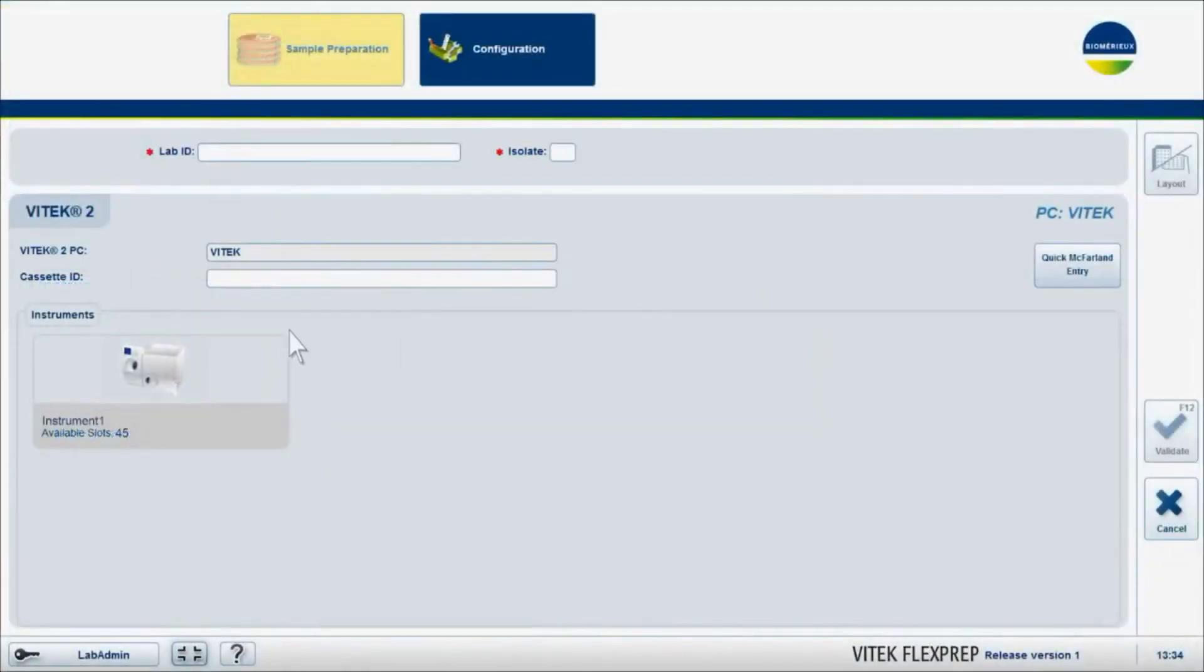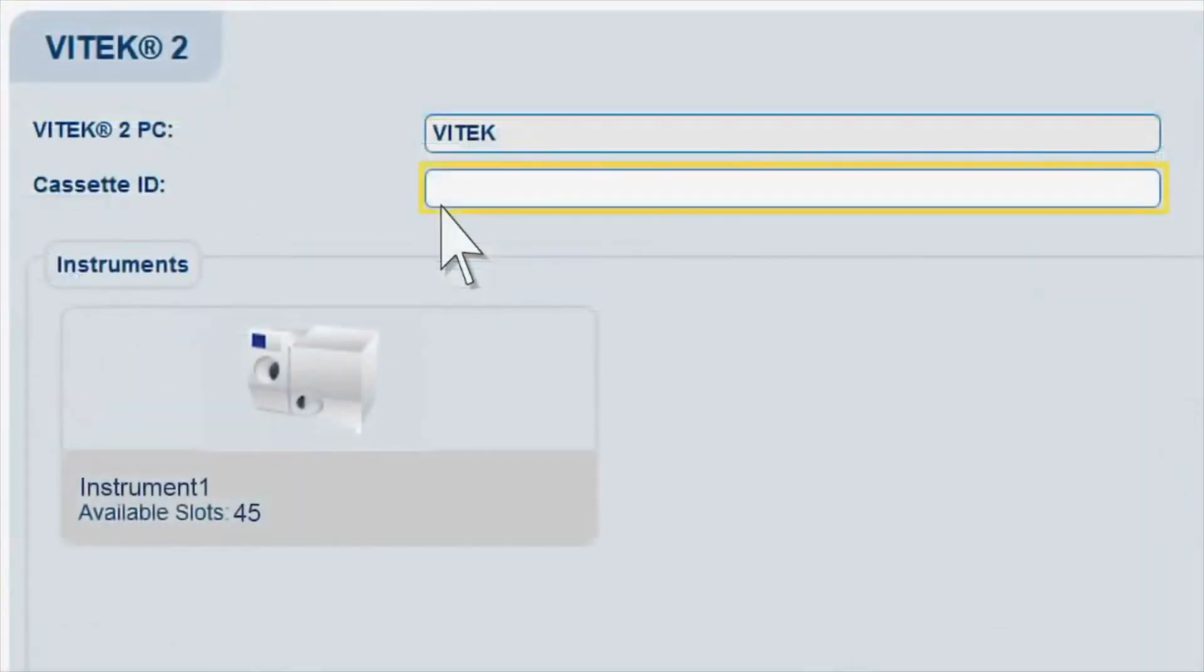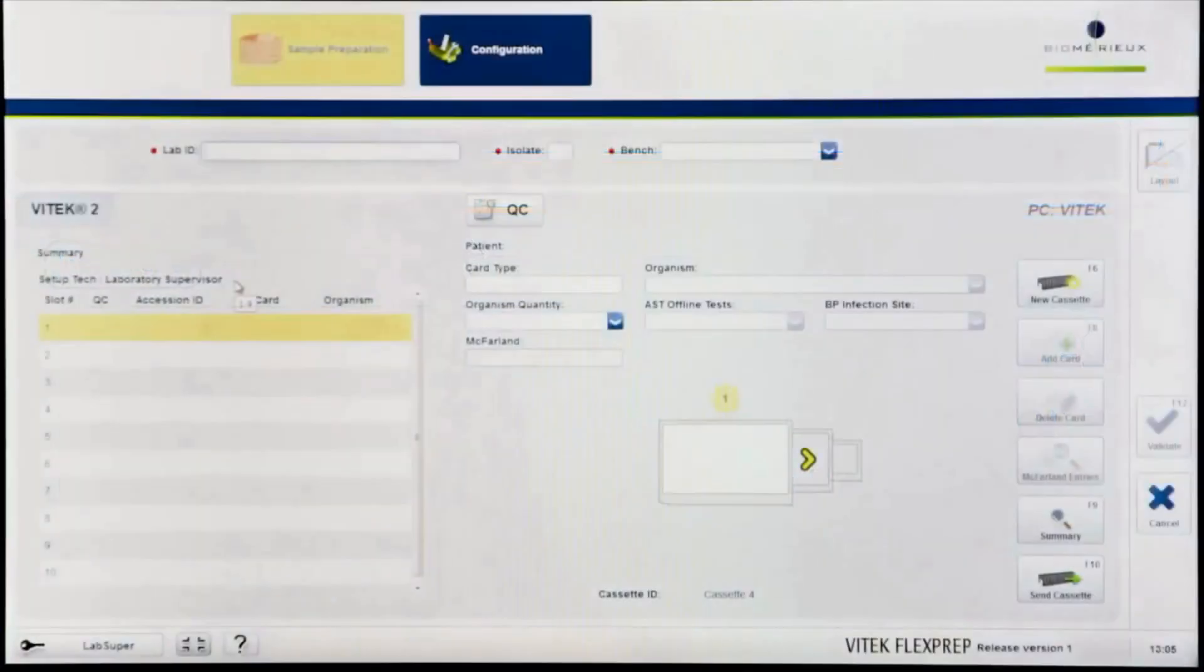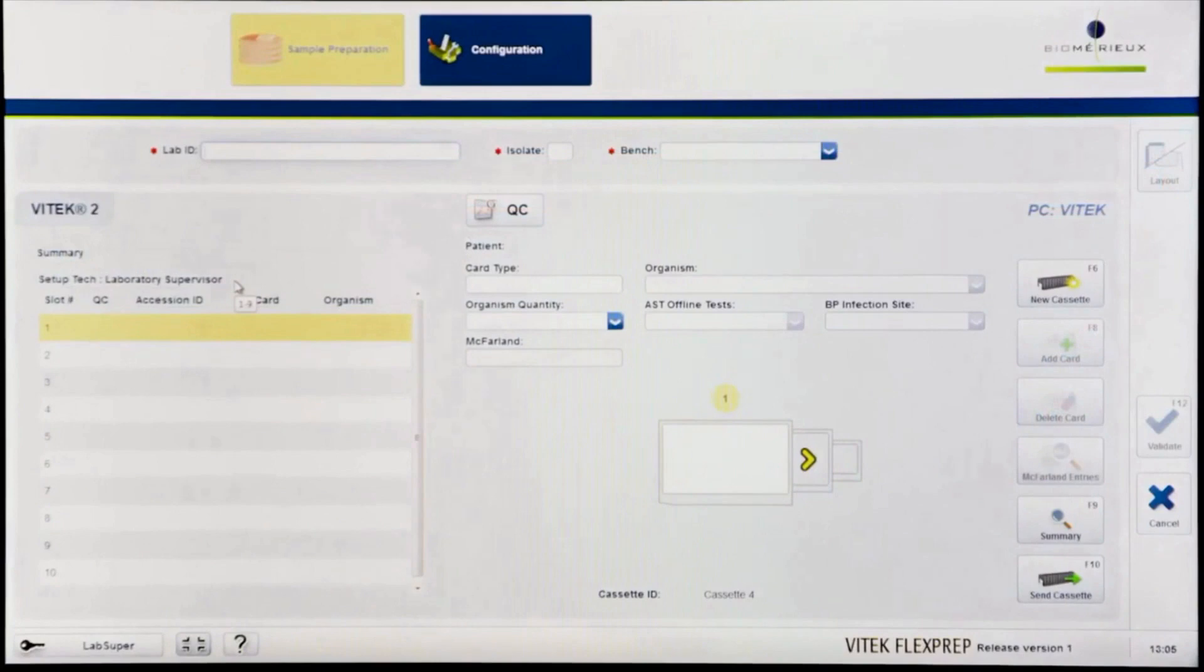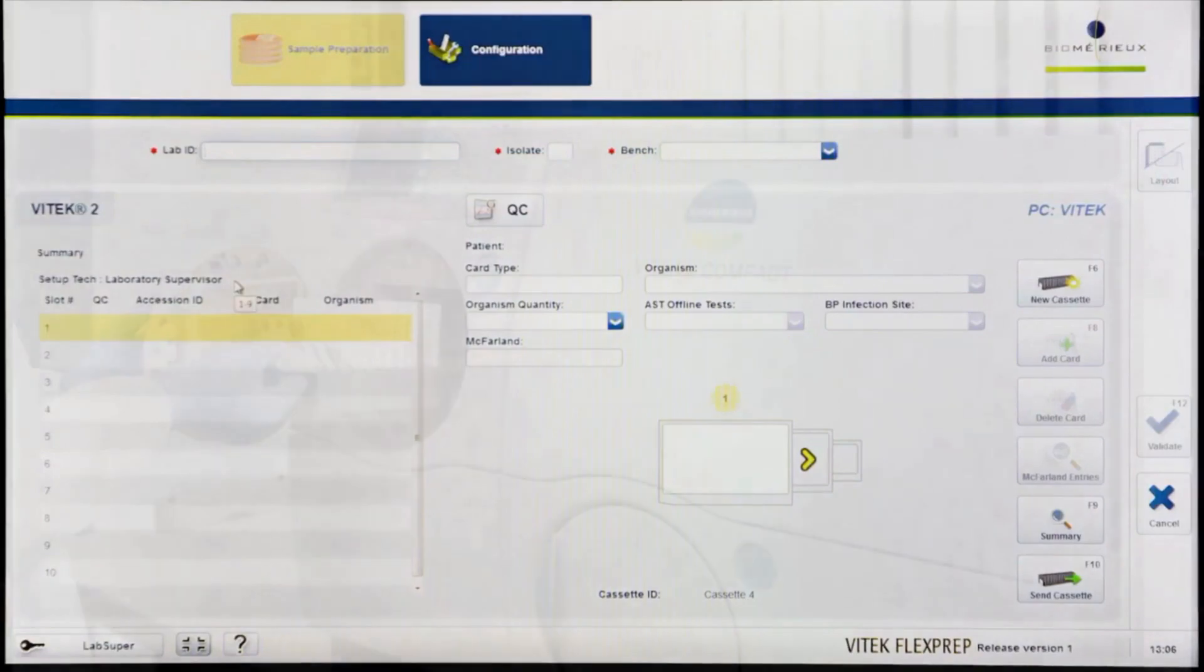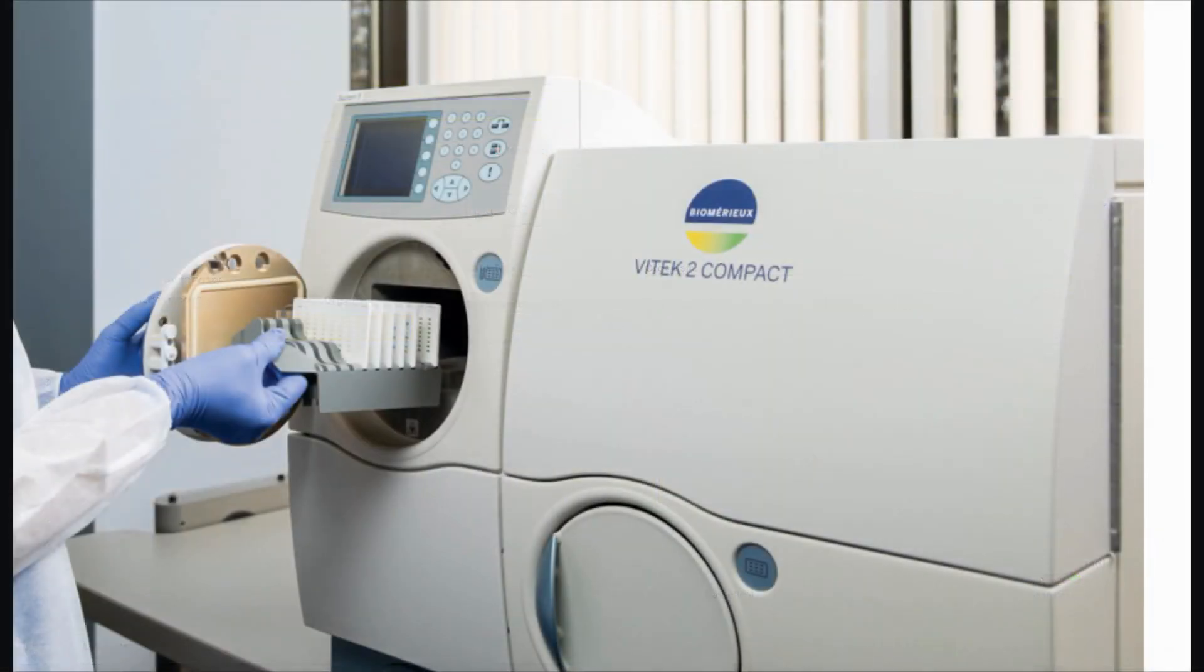Click in the Cassette ID field. Enter the desired cassette ID for the cassette in use and press Enter or scan the barcode located on the cassette. Only numbers 1 through 9 may be used for a cassette ID. There may only be one active FlexPrep cassette per cassette ID. If a FlexPrep cassette has already been defined utilizing the desired cassette ID, it must be loaded into the instrument before a new FlexPrep cassette can be defined with the same cassette ID.